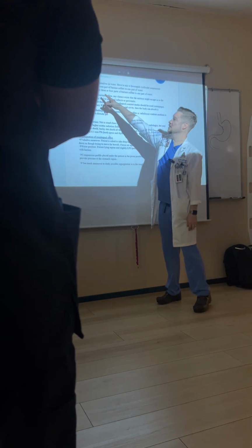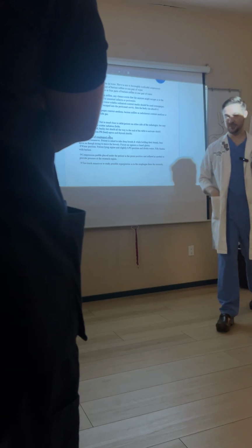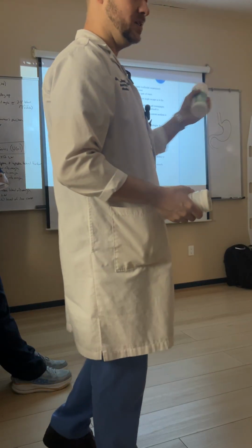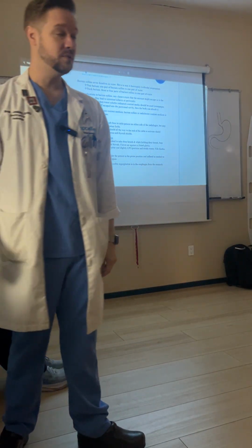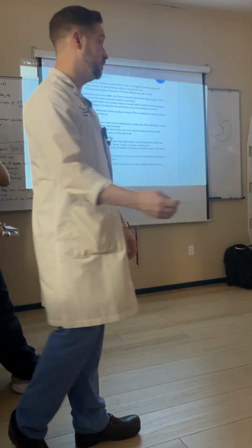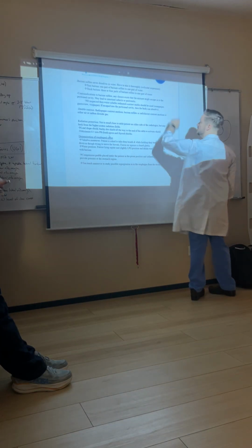Again, barium sulfate never dissolves in water. We have to mix it thoroughly. So you're going to fill this up, either one of these or both of these, to the top with water. If it's thick barium, you're going to do this the entire time you're waiting for the patient to come to the room, okay? And then before you start, you just want to make sure you give them one more shake before you give it to the patient, okay? Because it will settle, because it is a colloidal suspension.